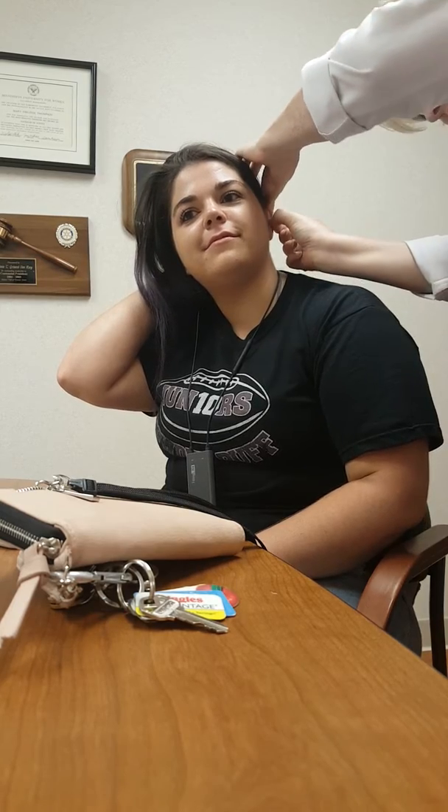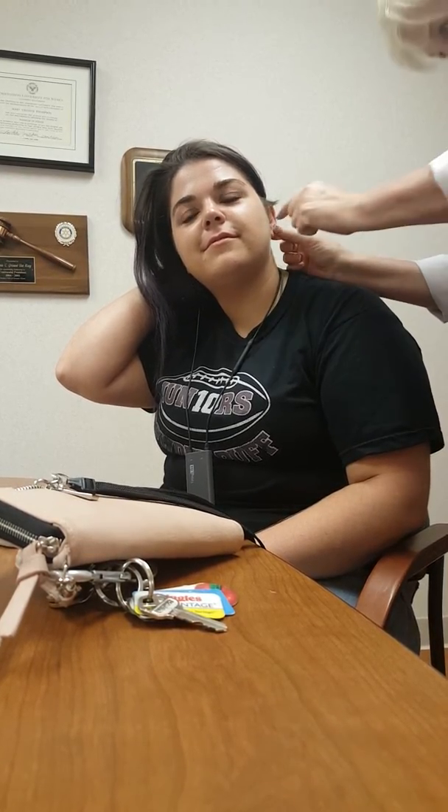Now when I put this in your ear it is not yet tuned to your hearing loss, okay? Don't freak out when you can't hear anything or it's too loud or whatever. I'm gonna go ahead and tell you — this all fits down in here but you've got to tuck that little piece up in there like that. Okay, we'll work on that. Put your hair down now. I'm gonna connect up to it and then we'll do some programming. Do I look like I have a hearing aid in my ear?